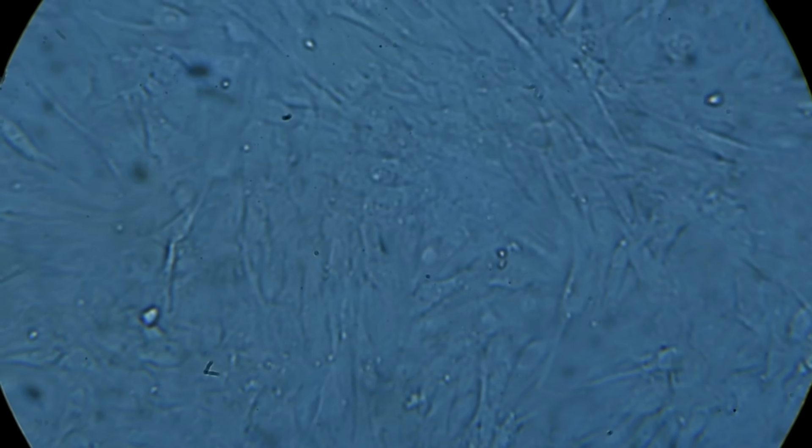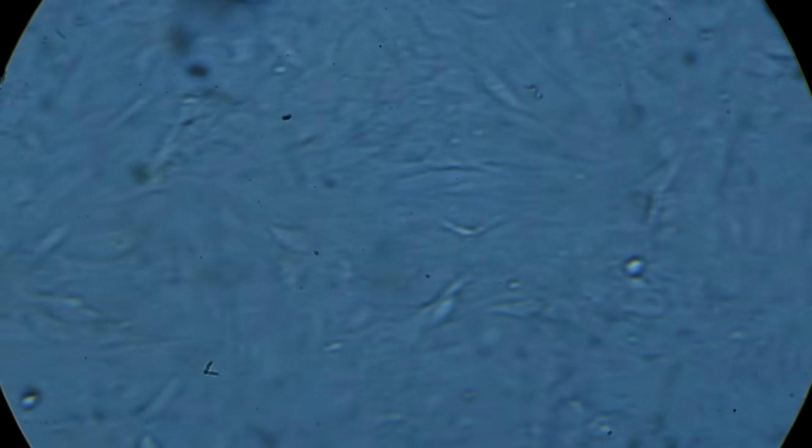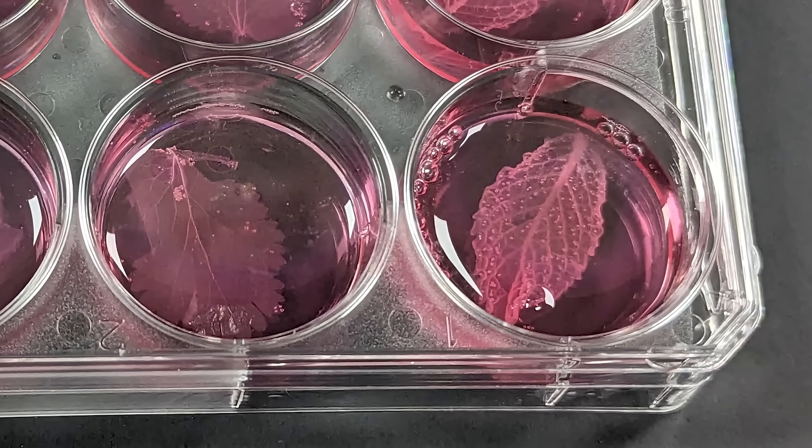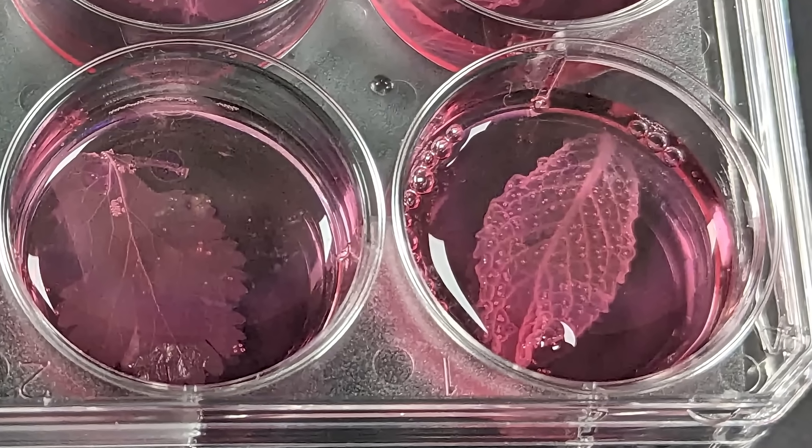Now, since the cells tend to flatten out when they're healthy, and are actually pretty hard to see even when they're on plastic, we're going to need to stain them to see them. That way, we'll know if they've adhered, and if we have a proper meat leaf.